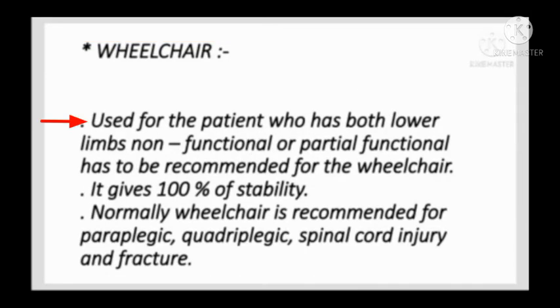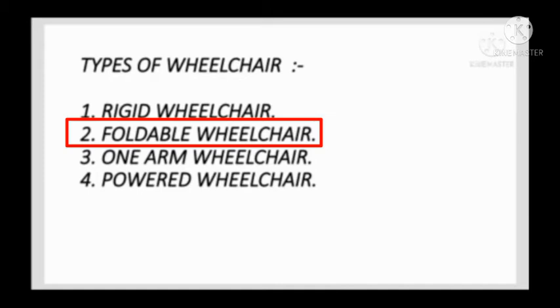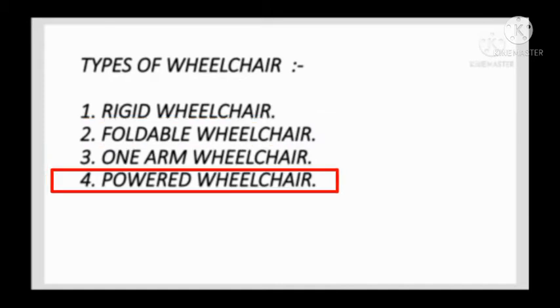Wheelchair. The patient who has both lower limbs non-functional or partially functional has to be recommended a wheelchair. It gives 100% of the stability. Normally, a wheelchair is recommended for paraplegic, quadriplegic, spinal cord injury and fracture. Types of wheelchair: rigid wheelchair, foldable wheelchair, one-arm wheelchair, powered wheelchair.